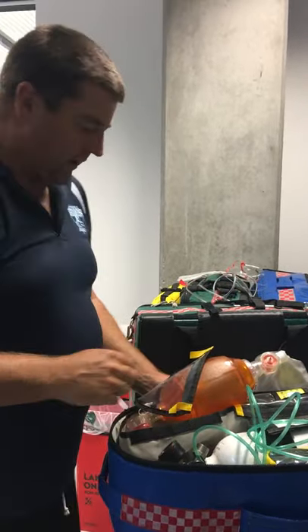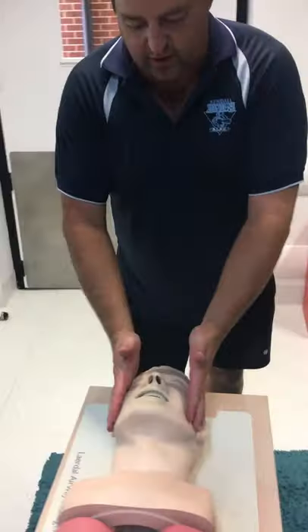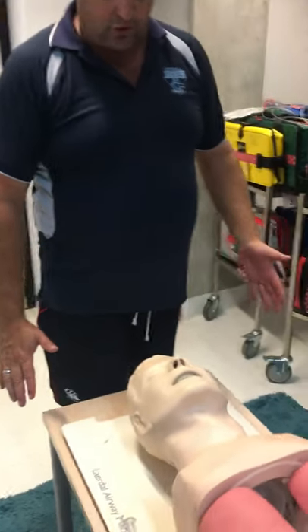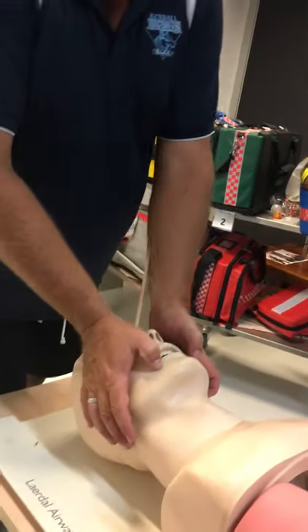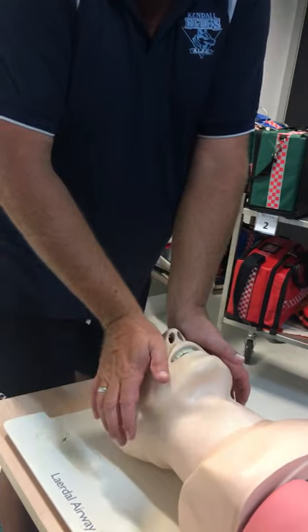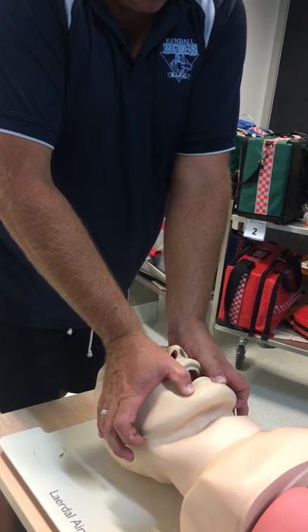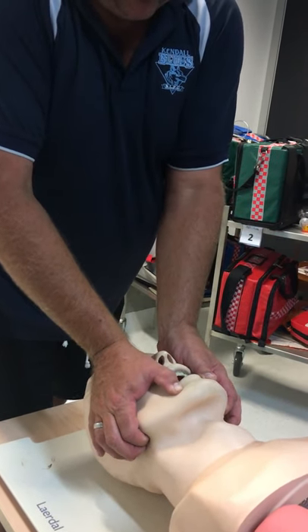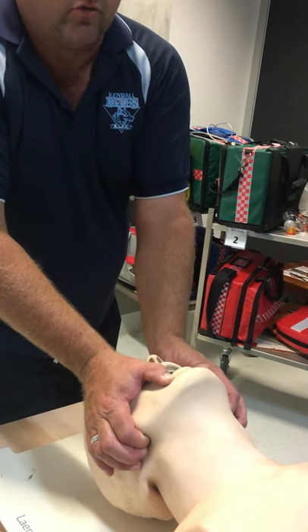Now, airway maneuvers. If we have an unconscious patient lying on the ground, we need to do a triple airway maneuver. Number one: put the heels of your hand over the patient's jaw and push the jaw down. Secondly, fingers under the angle of the jaw and lift the jaw up. Thirdly, tilt the head back — triple airway maneuver.